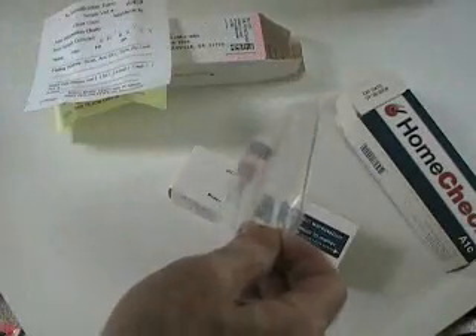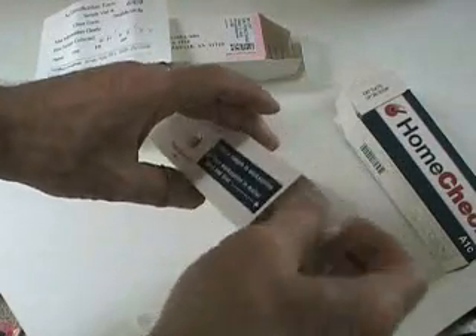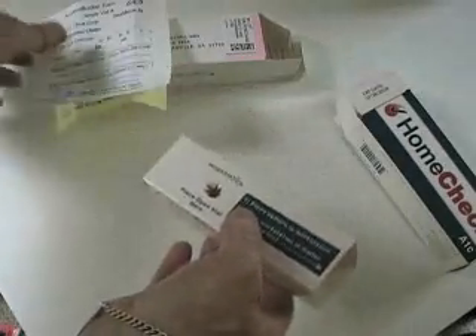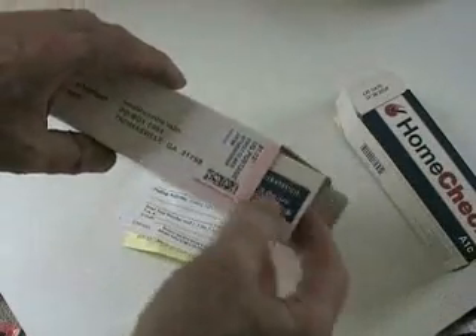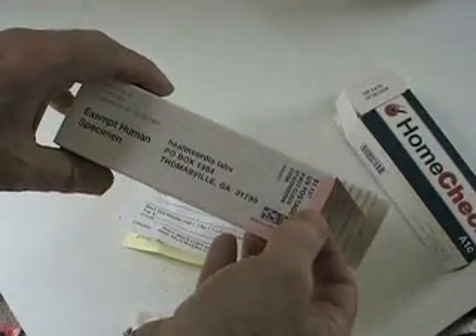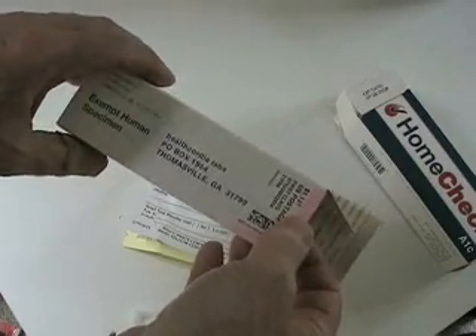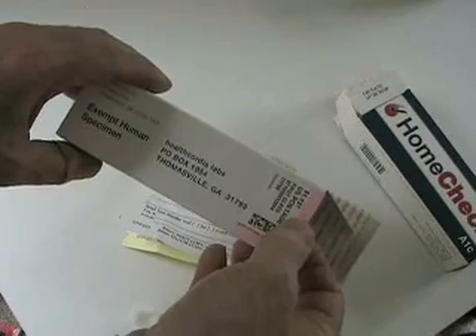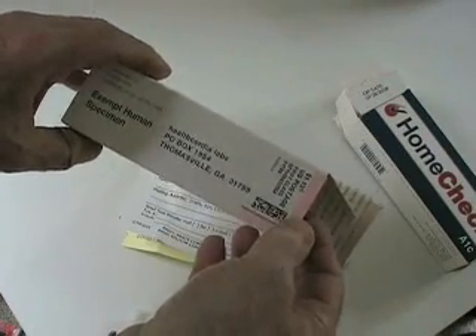I'm going to put the Ziploc bag inside the workstation, and put the filled-out form in there also. And I'm going to put it in this box and send it back to HealthCordia. If the last time is any example, within five or six days I'll get the results of my A1C back by email.